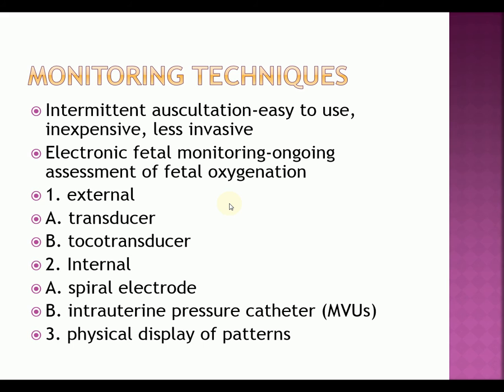I really like that wireless and beltless system that you see given. They give you an example of that. This is only used in hospitals that can actually afford this particular type of machinery. I think it would be very awesome, because then the patient can get up and ambulate and move around and do whatever they need to do instead of tying them to the bed.